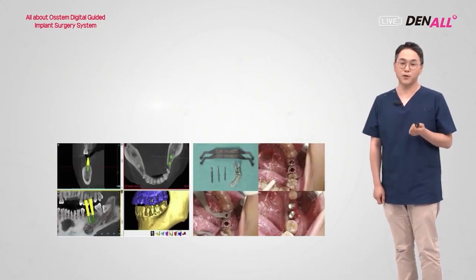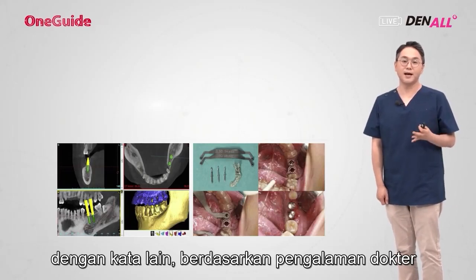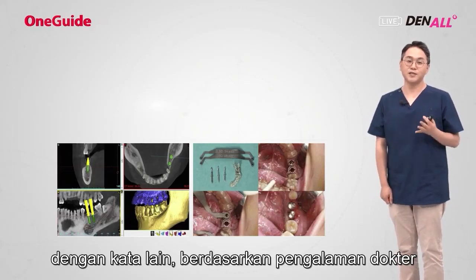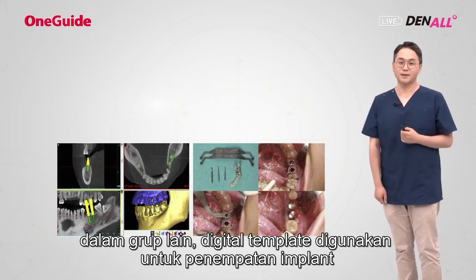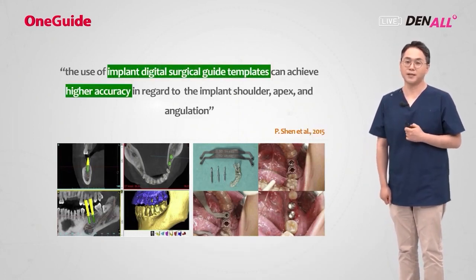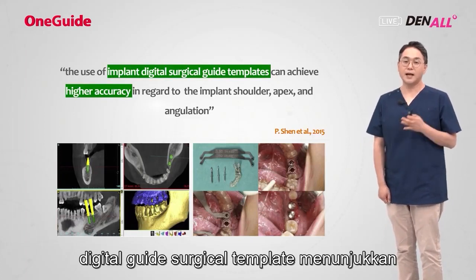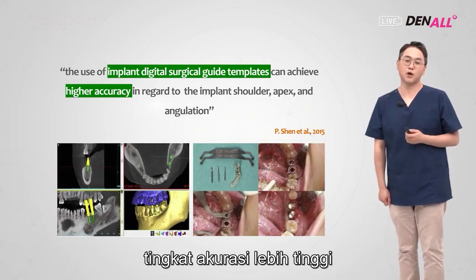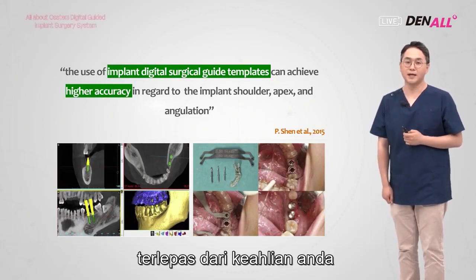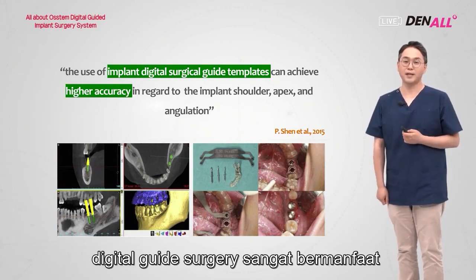Using Simplant, planning was done. In one group, freehand surgery was done, in other words, based on the surgeon's experience. In another group, a digital template was used for implant placement. Regardless of how experienced you are, the digital guide surgical template showed higher accuracy. Regardless of your expertise, digital guided surgery was very useful.